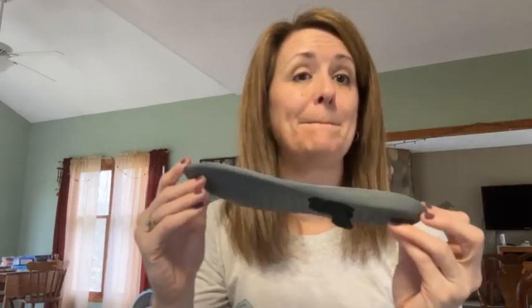So here's your little bit of a sneak peek. Basically, what we have are these teeny little sensors that go inside. I have a box of insoles of different sizes. The technology slides into the insole, and then the insole we put in your shoes. The only limitation is that we have to be in a place where there's cellular service or Wi-Fi.